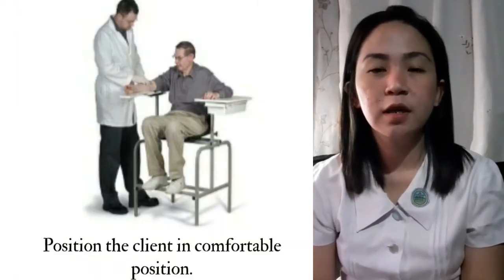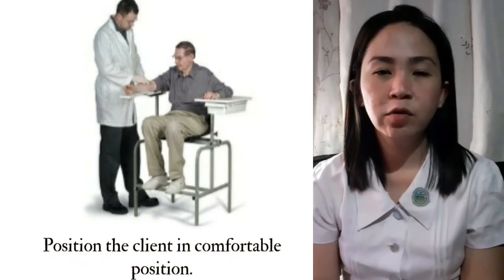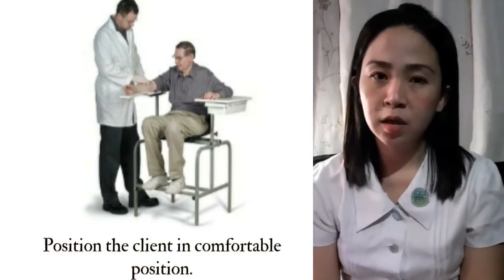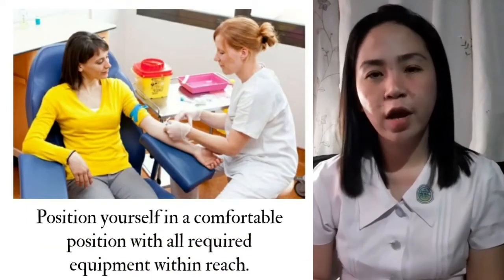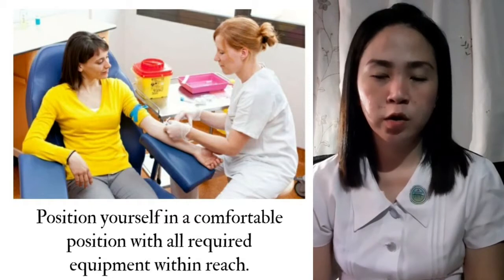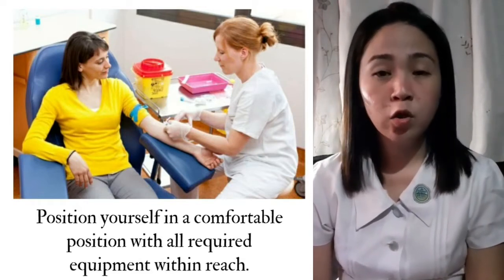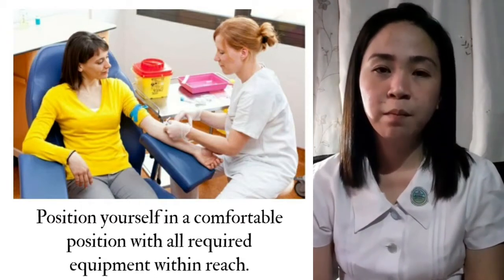Make the patient comfortable if you sense any anxiety or fear. Position the patient in a comfortable position — the patient should either sit in a chair, lie down, or sit up in bed. Ask the patient to extend their arms; their hands should be dangling so the blood rushes down and fills the vein. Position yourself comfortably — when performing venipuncture, make sure to sit whenever you can, as it gives you more stability and relaxes you. You will need full access to the arms, so sit in front of the patient and slightly to his side.